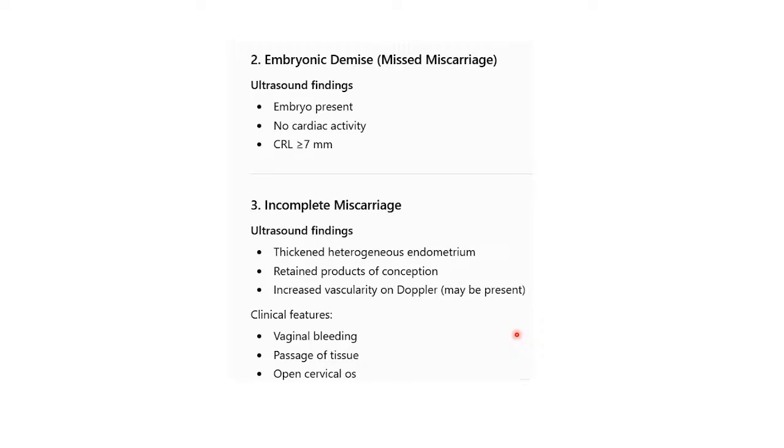So what are the ultrasound findings? What is it they're looking at? You don't just do a scan nonchalantly without understanding exactly. You must have a map. It's just like a builder who's building a house. They have the design, the plan for the house. They know exactly what to do next. It's methodical. It's procedural. So when you're doing an ultrasound scan, it has to be procedural, it has to be methodical. You have to take it stepwise. Know what to look for. Know the pitfalls, so that you give a comprehensive and a correct report.